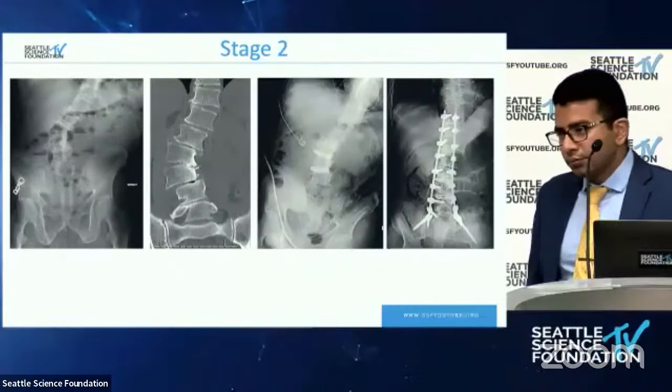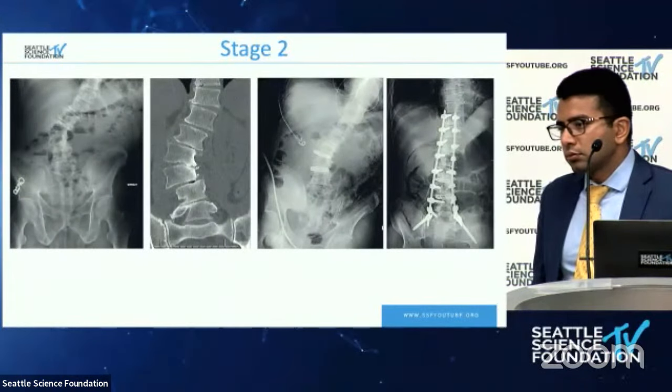Yeah, those are excellent points, and we try, just like an open surgery. Neil was there, with navigation you can see the facet joint, and we just drilled it out, you remember? We just drill out the medial part and then put allograft in there, just like you would do in an open. Again, with navigation it's gotten easier, but these are very challenging cases. I wouldn't recommend that you go out and do one tomorrow.